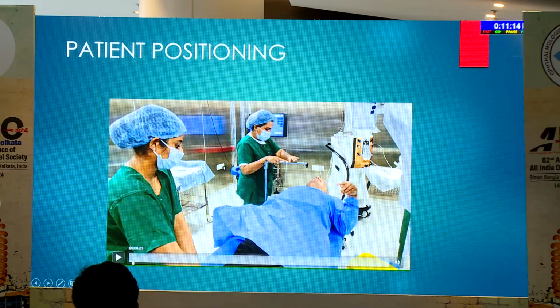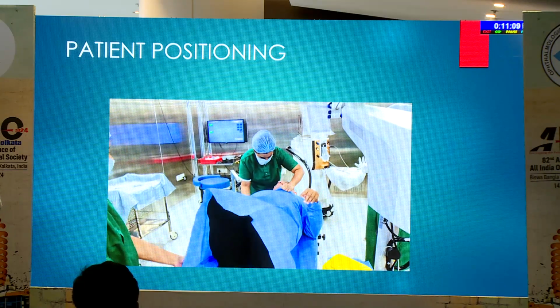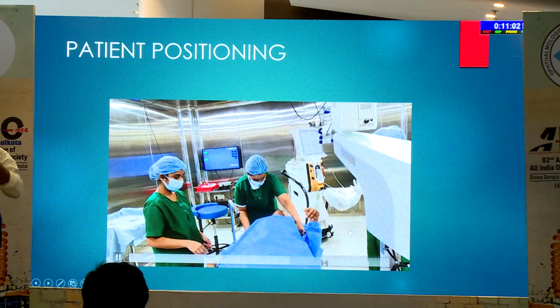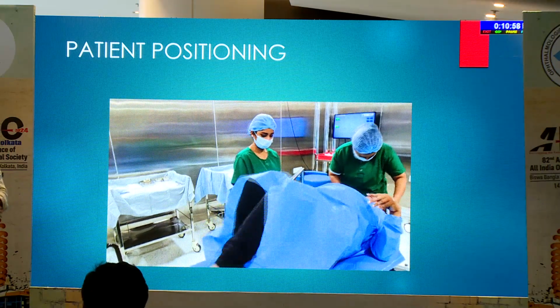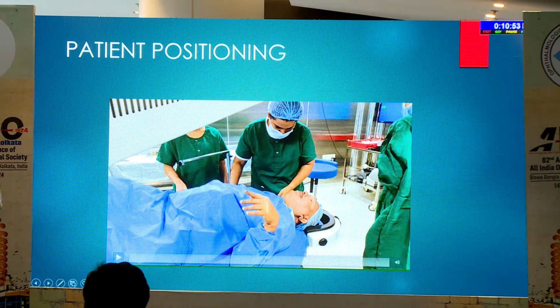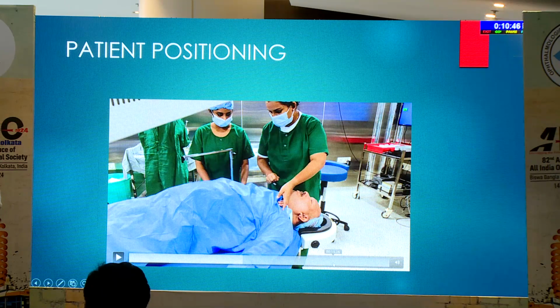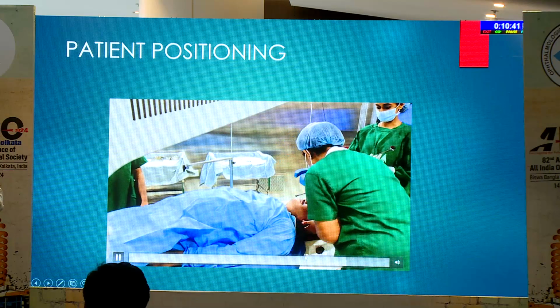So all these have to be taken care of by the sisters. It's always better if you're sitting in the OR room. Make sure that you supervise how they position the patient. Most of the time the patient will have a habit of turning the head to one side. And if you just walk in and sit, you will not get the ideal position in which you require. Again, this is also about head positioning. You may need to lift the patient, especially if the patient is having some weakness of the arms. You will need to just pull him up and position him properly.